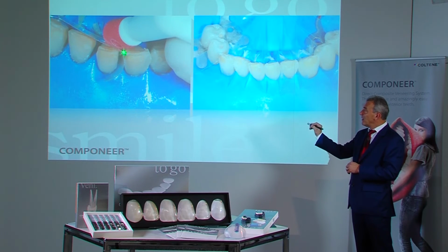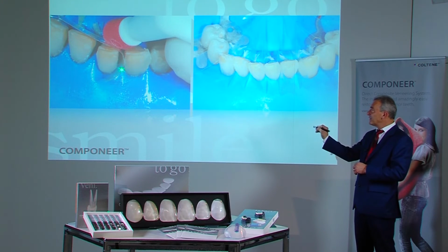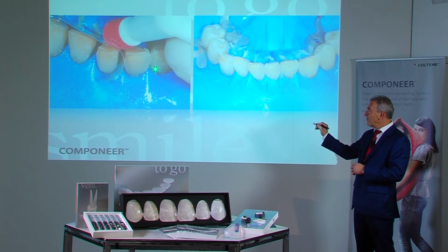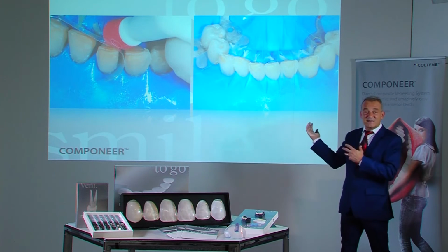Again, one can see the matrix is placed in the sulcus, is retained in position using the placer, and is then filled with composite. This is the base for placing componeer.